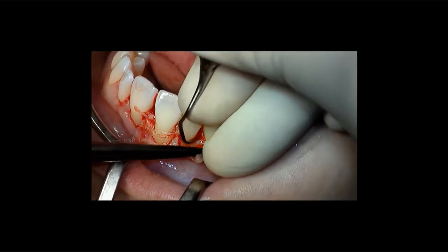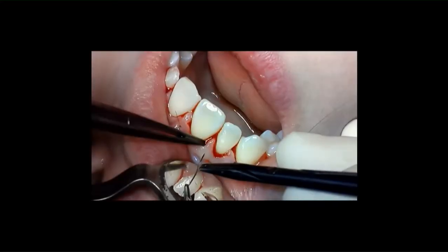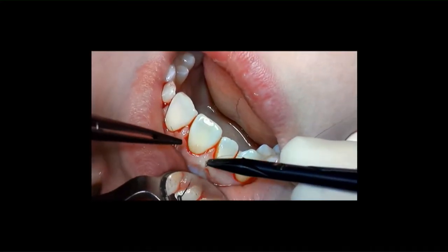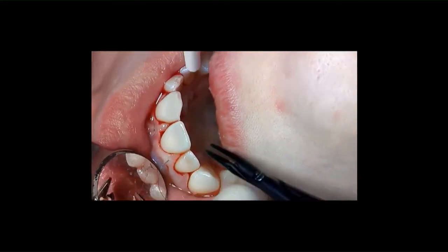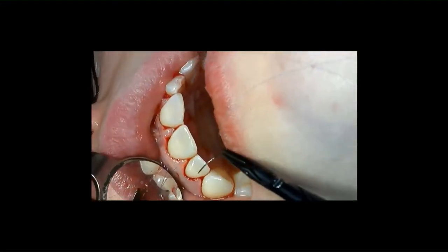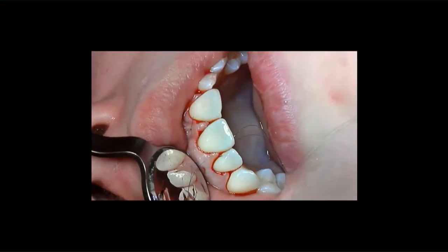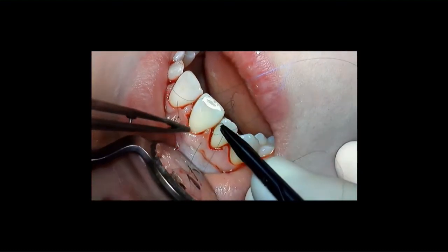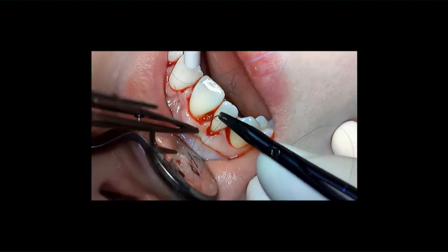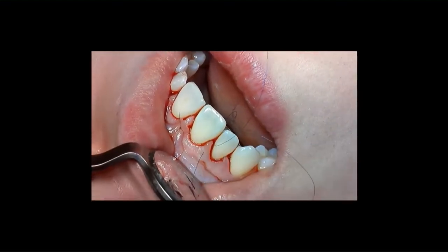And my incision in this case, of course, we could make an incision and leave the papillas as well. But I've had some cases with some nasty scar tissue in that zone. So preferably nowadays I use this technique. And finally, we place vertical mattress sutures, preferably monofilament 7-0, and it normally heals really, really well.